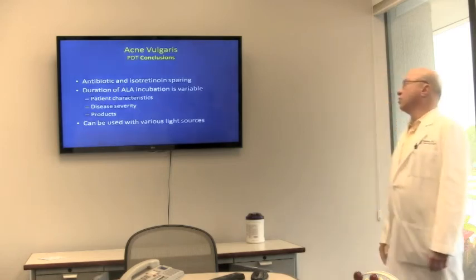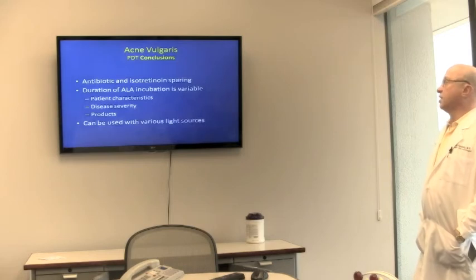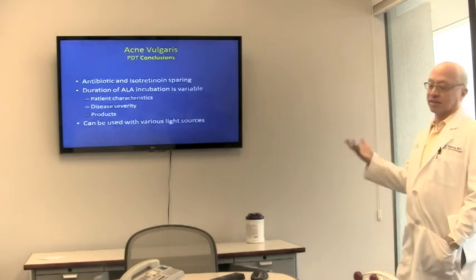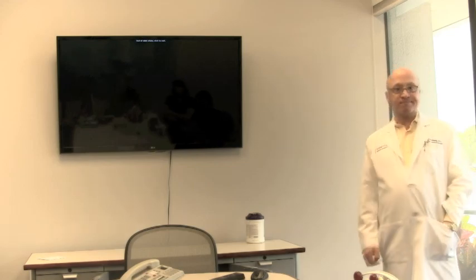And so as I said, we tend to use it because people increasingly don't want antibiotics, don't want Accutane. How long we incubate the ALA is going to be all the things we talked about. And like I said, BBL is fine, red LED is fine. That's it. Cool. Thank you.